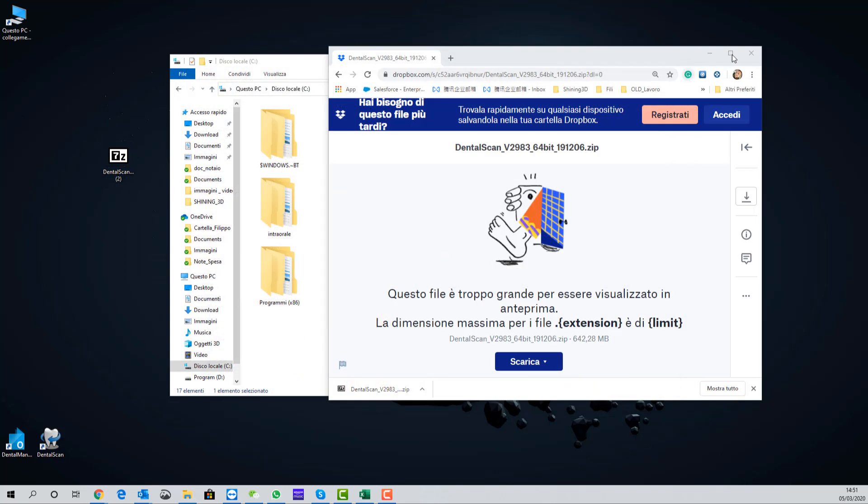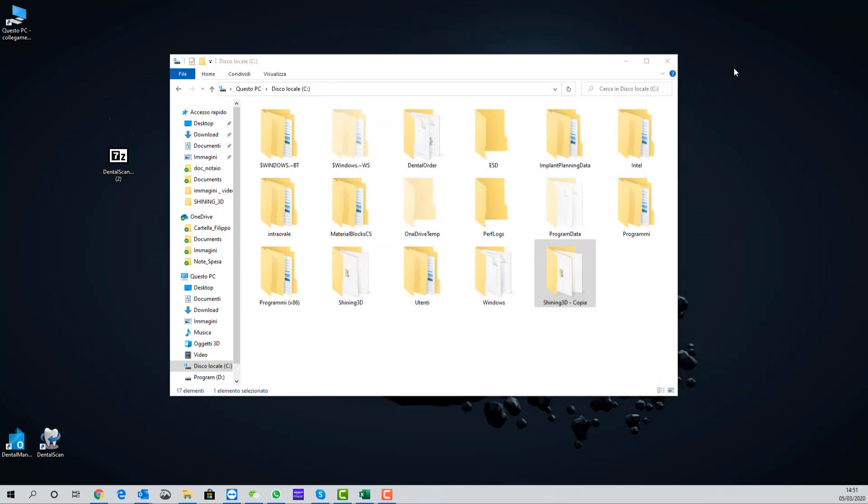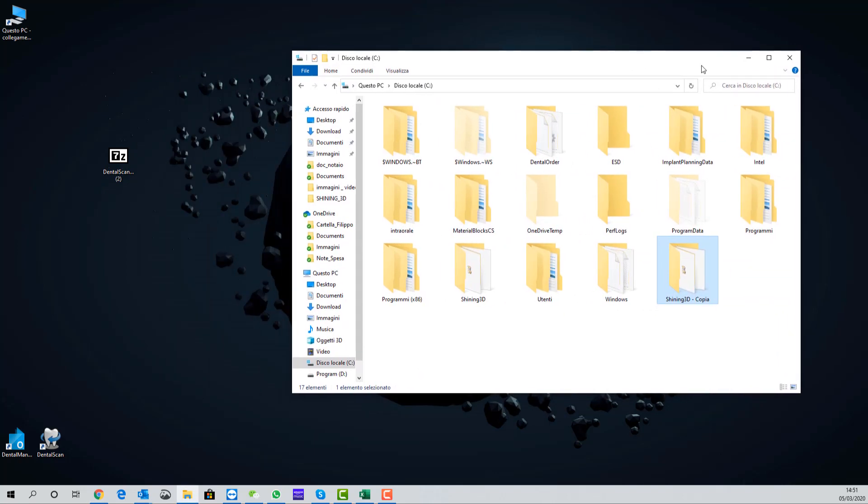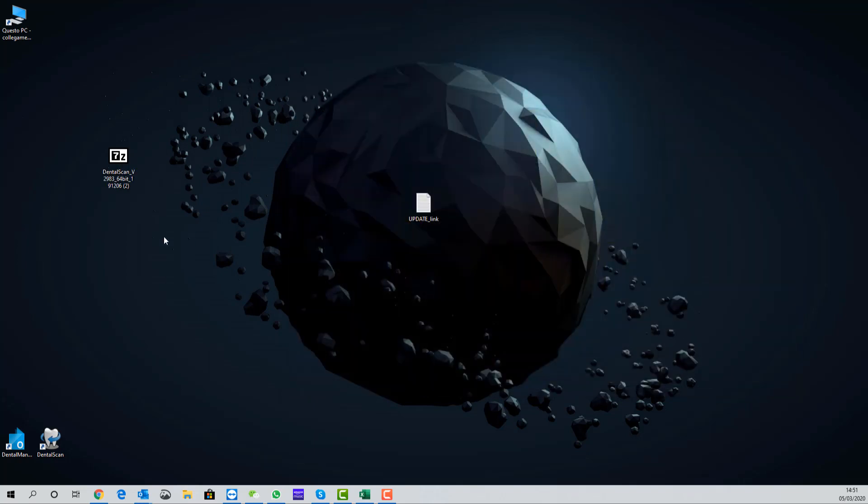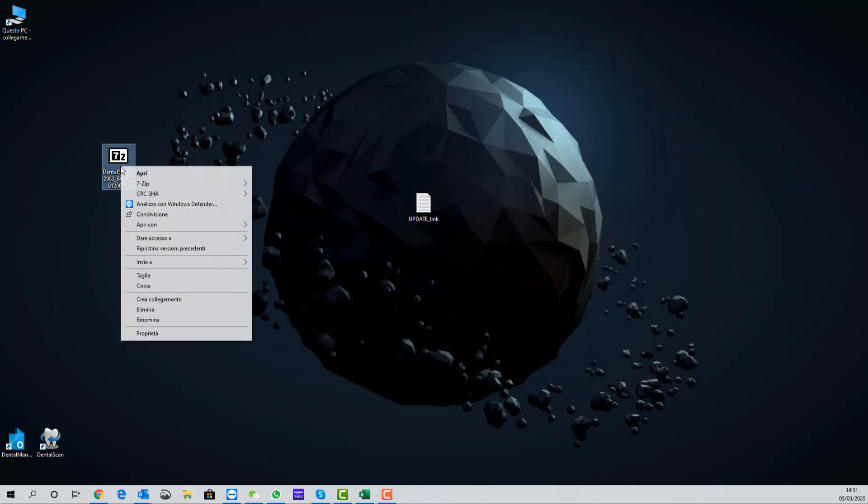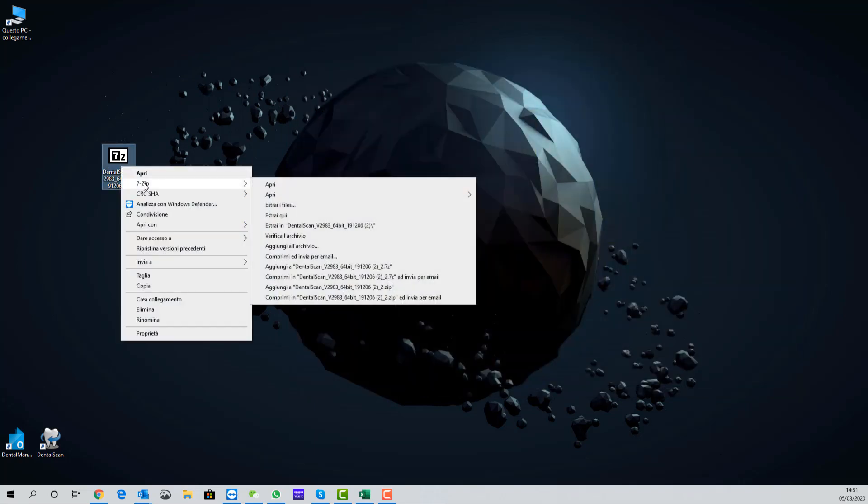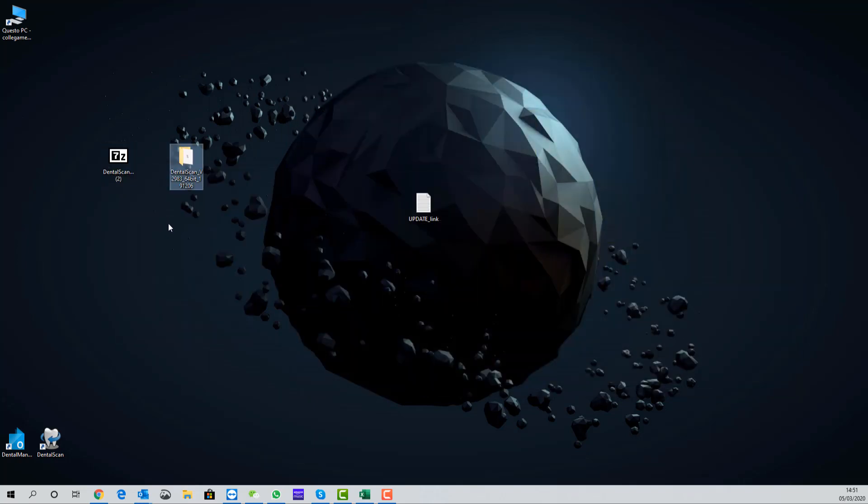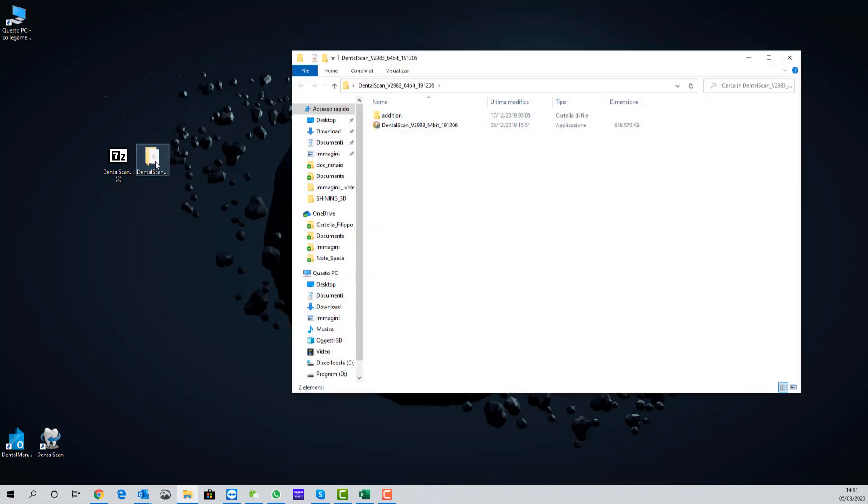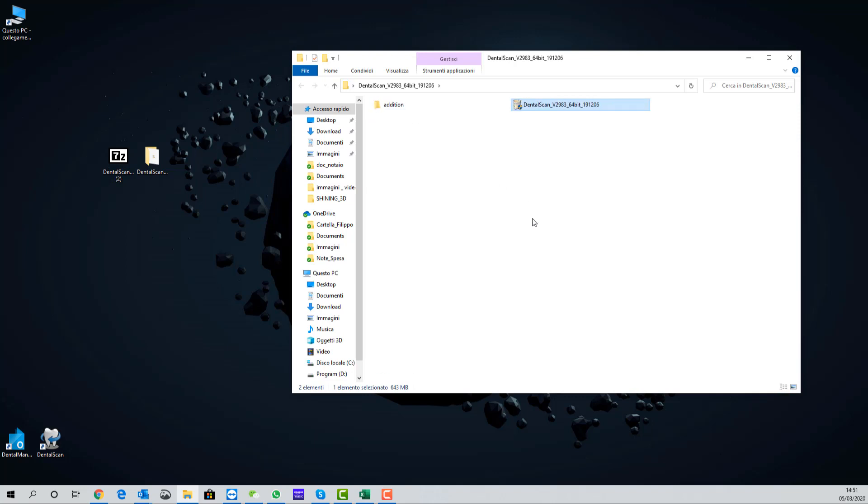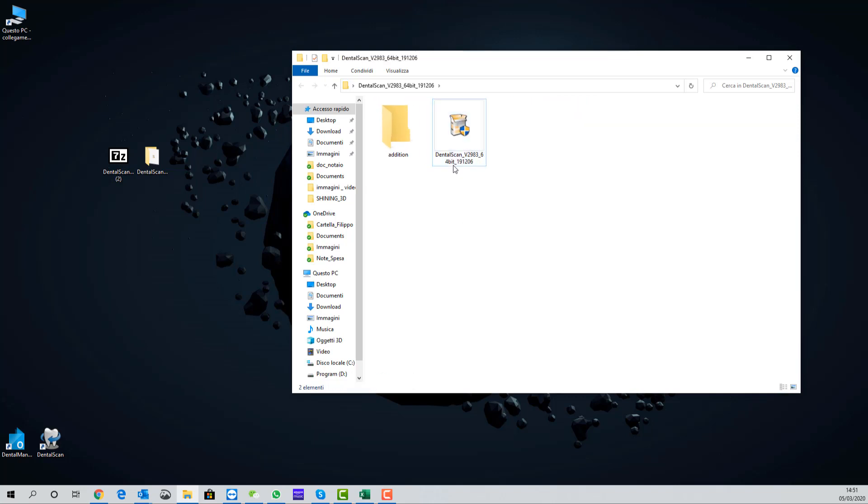When the download is complete, we can unzip the installation pack on our desktop. Then open the folder and double click on dental scan button.